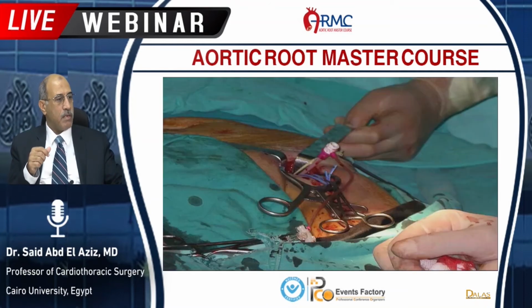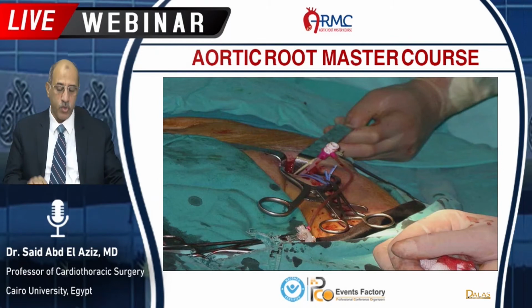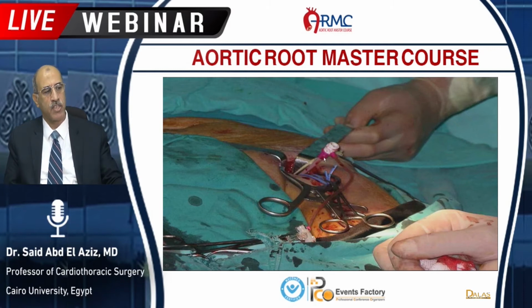Then we will move to the next step. We choose the stent, which type of stent, and whether we will use one stent or two stents. So preparation is to prepare the cut down, and then this is an introduction sheath, what we call the femoral sheath.